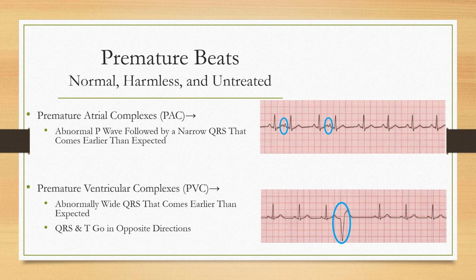So it has to go from myocardial cell to myocardial cell and depolarize the whole ventricle, but it takes longer, and that's why it's a wide complex. Compared to a premature atrial complex that starts in the atrium, but then goes to the AV node and uses the fast nerve bundles. So there's a narrow QRS complex. Okay? Okay, we'll move on here.